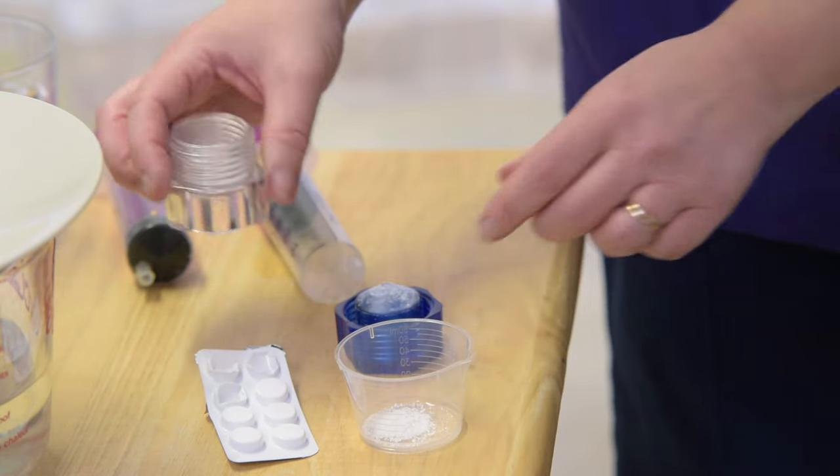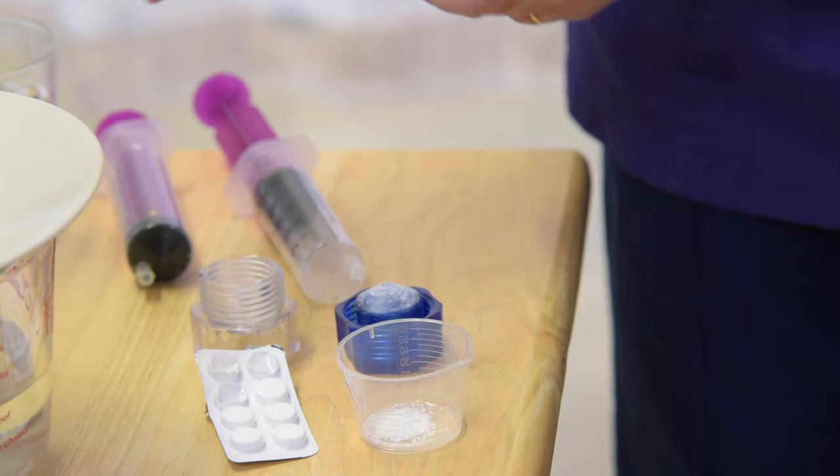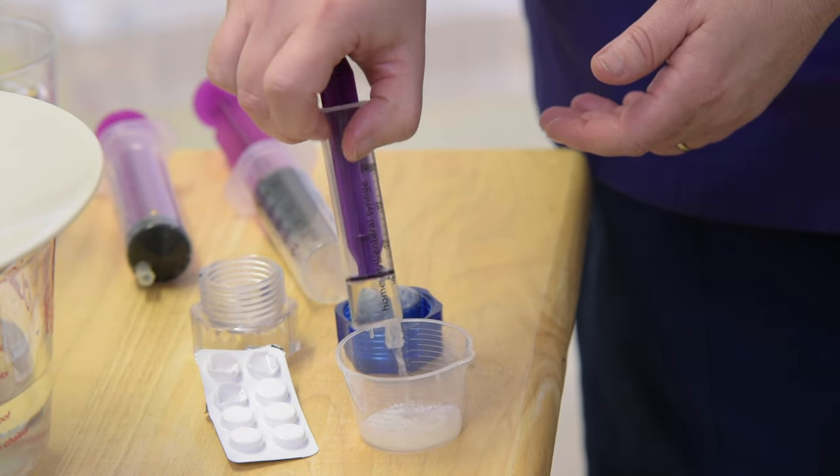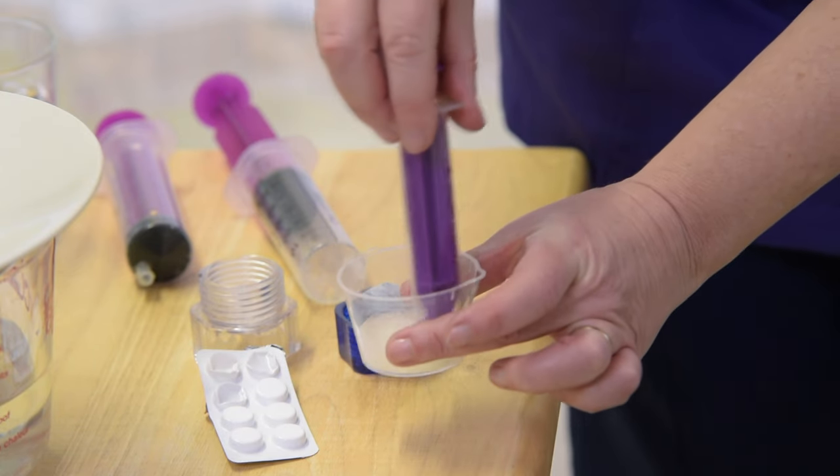Empty the powder into a small cup or glass and add 10ml of cool, boiled water. Stir well and draw the water into the syringe. Not all medications dissolve easily and you may need to add more water.